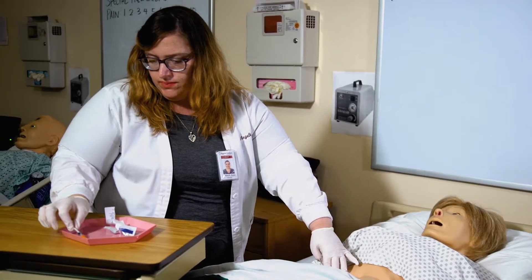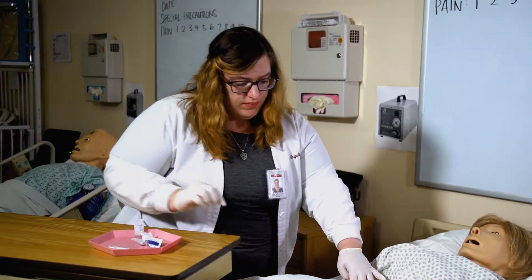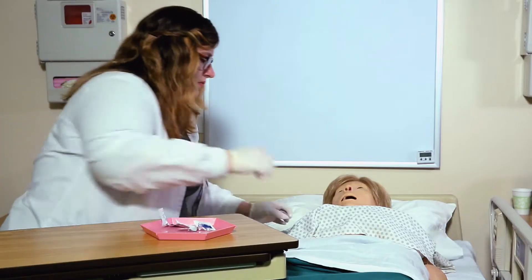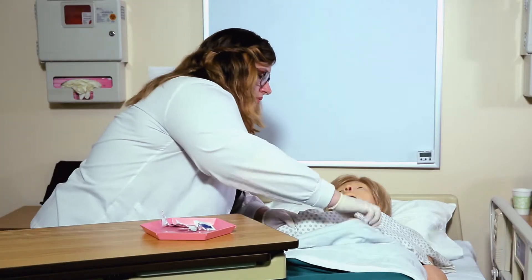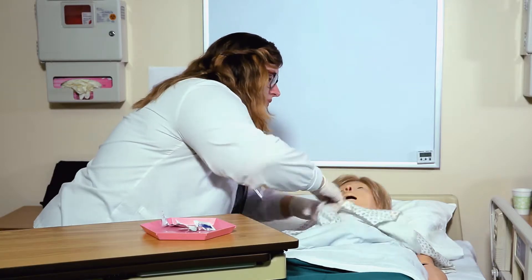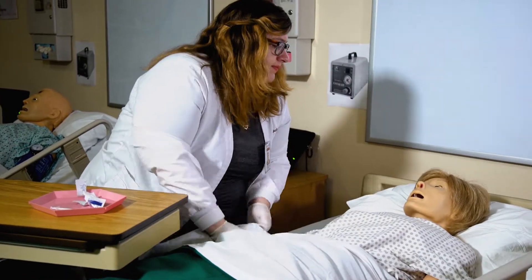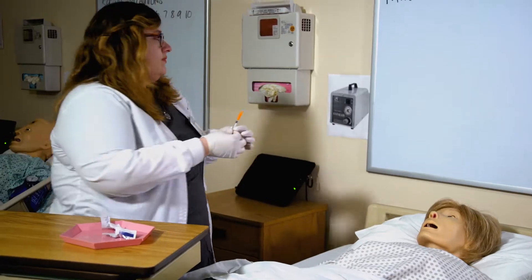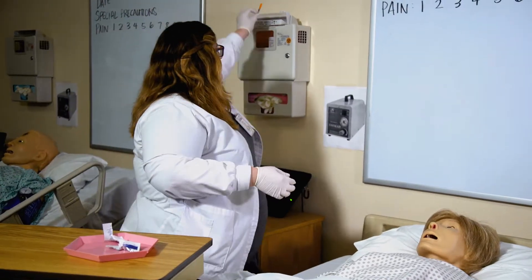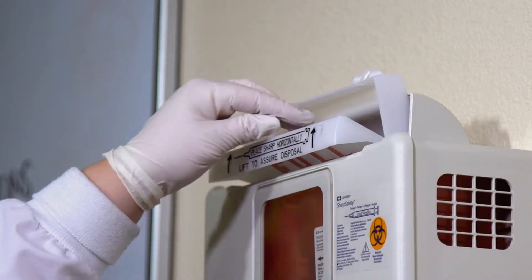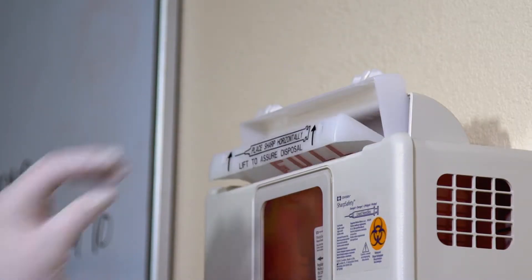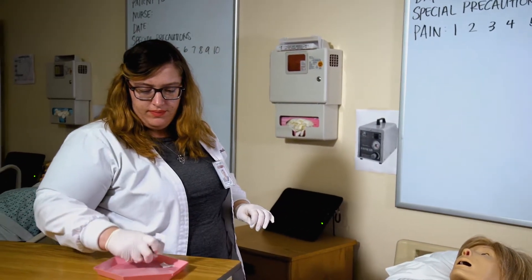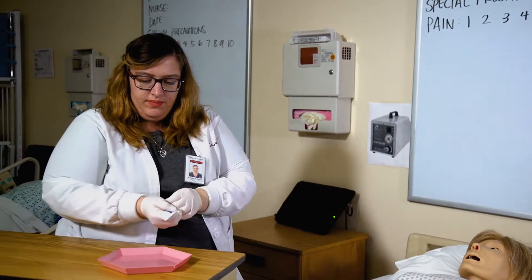Grasp the lower end of the syringe with the non-dominant hand and position the dominant hand at the end of the plunger. Do not move the syringe. Withdraw the needle while applying gentle pressure with the antiseptic swab. Note: do not push down on the needle with the swab while withdrawing it, because this will cause more pain. Discard the uncapped needle and syringe in the sharps container. Do not recap used needles. Remove gloves and wash hands.